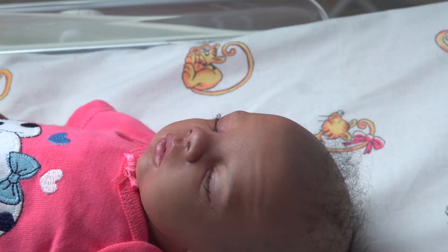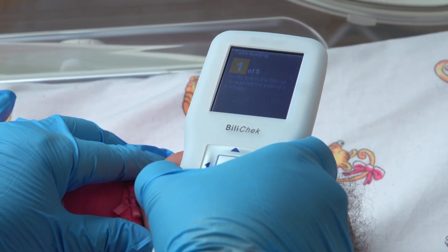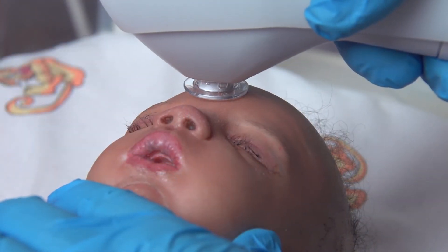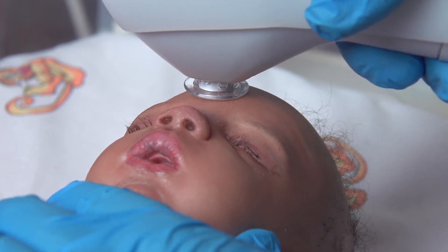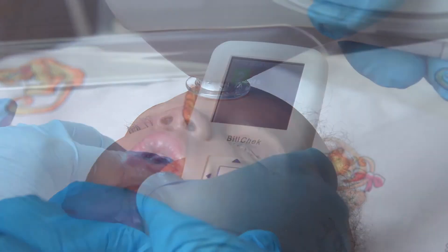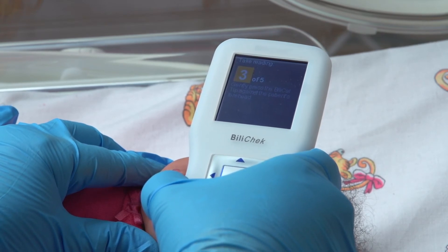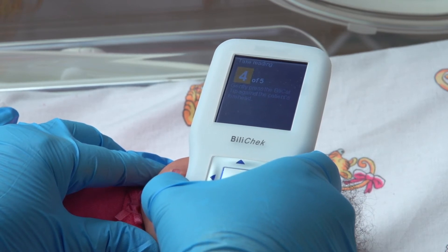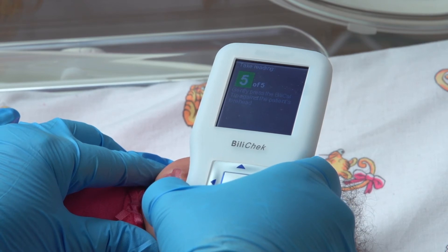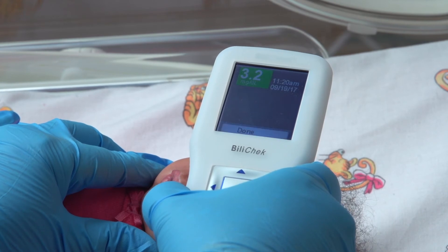Gently press the BilyCal tip to the selected measurement area. While maintaining skin contact with the BilyCal tip, lift the handheld unit slightly from the patient's forehead or sternum and then repeat the process four more times. A measurement requires a series of five successful readings from the same site. The measurement number on the display changes from yellow to green when proper pressure is applied, and returns to yellow if excessive pressure is applied. A single tone sounds after each reading to indicate that it was successful.